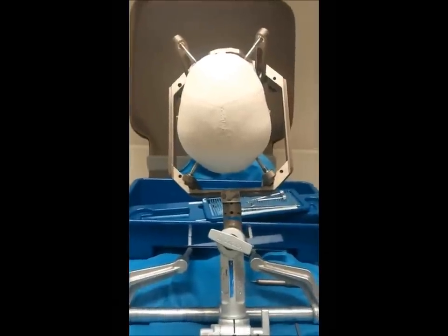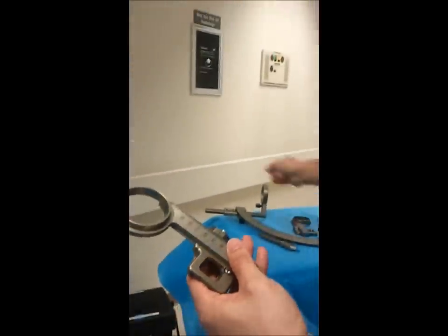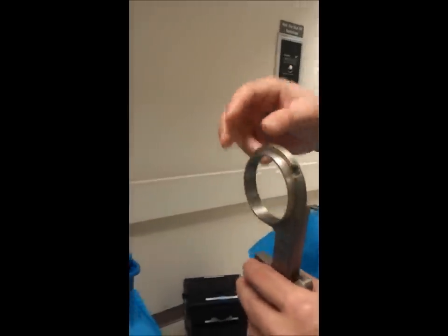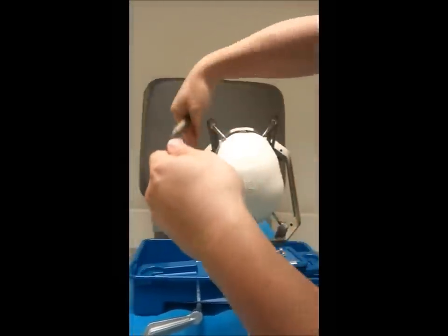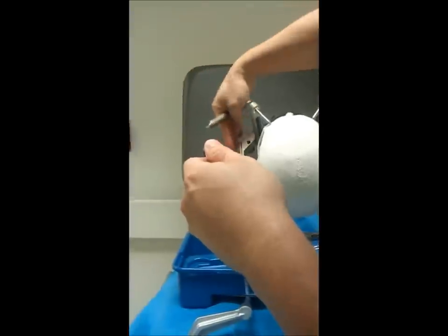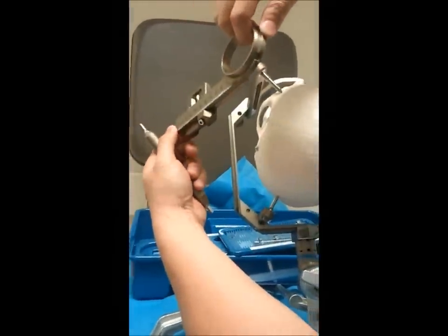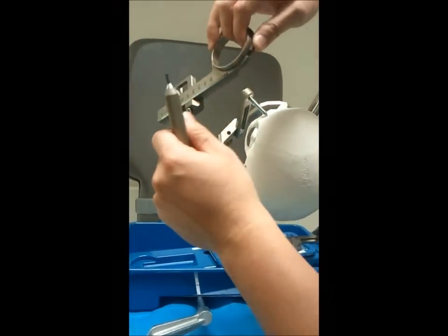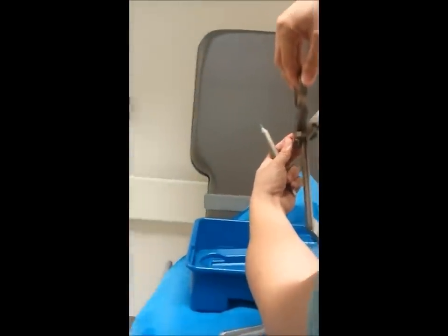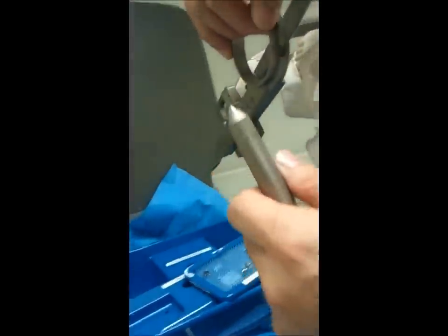If you decide to now program your coordinates, you want a pair of sterile gloves. The next thing we'll do is have one individual with sterile gloves — after the coordinates for the verticals have been set, placed arbitrarily at 90 — hold the ring sterilely and very carefully avoid contaminating themselves on the rail, on the patient, or on the hair. Another physician with a sterile or non-sterile screwdriver can assist, with somebody holding the ring and the physician adjusting it.